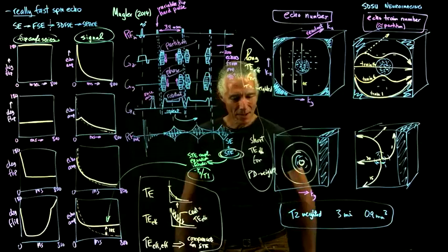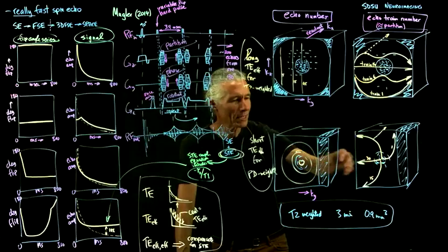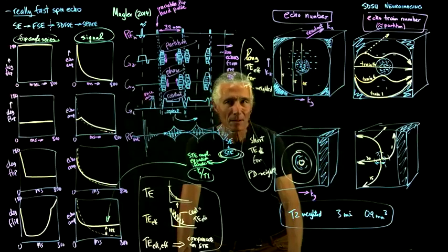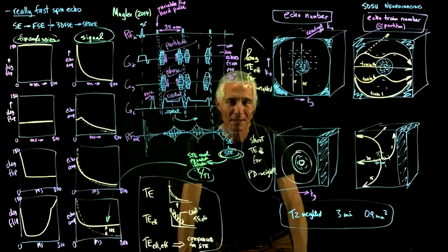I think you could probably go even faster than this if you do some of those things that I was talking about in the 8 a.m. lecture, where you did some kind of compressed sensing, where instead of just leaving out the corners of k-space, you left out some data inside of k-space. Then you could probably get an image like this in 1 or 2 minutes, and that's definitely good, because you could do all different kinds of images, or you could just do a higher resolution image.